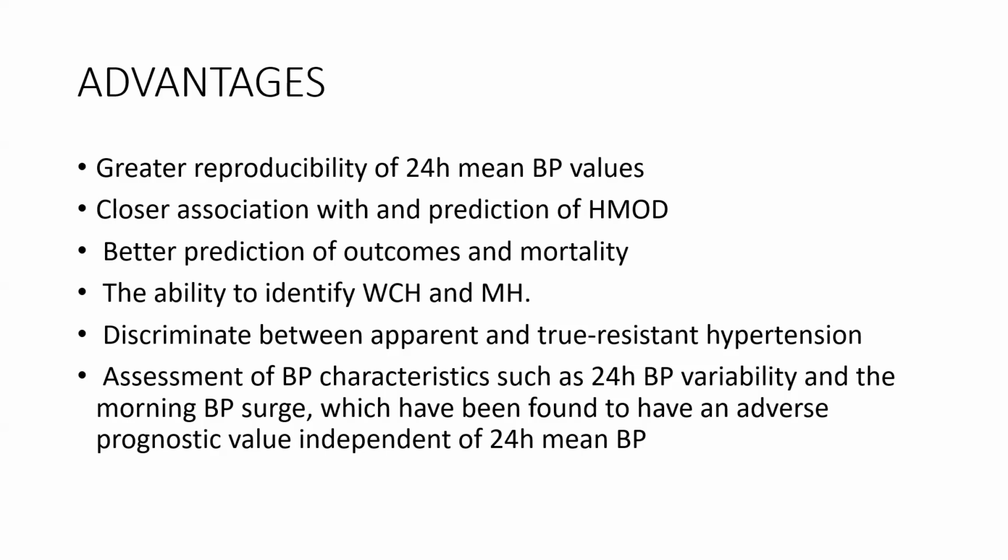It's able to discriminate between apparent and true resistant hypertension.